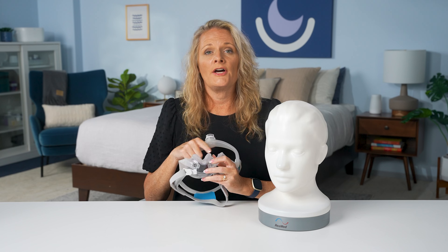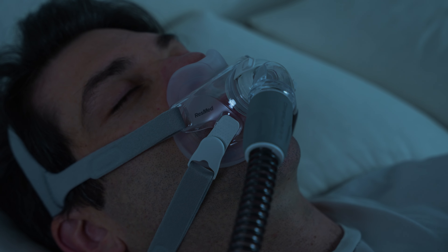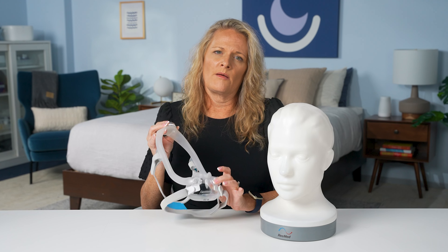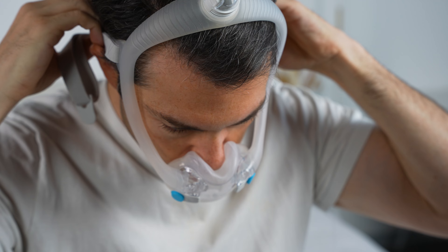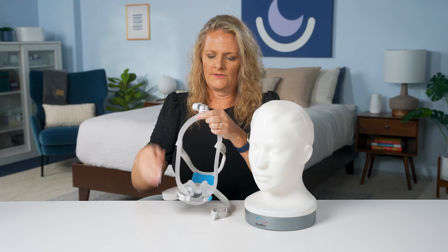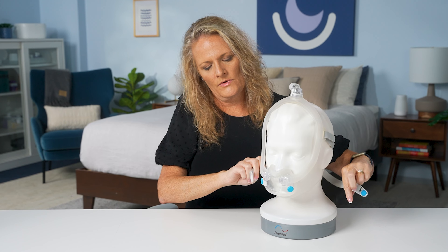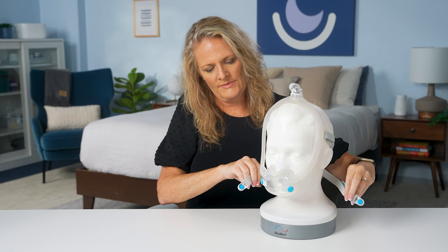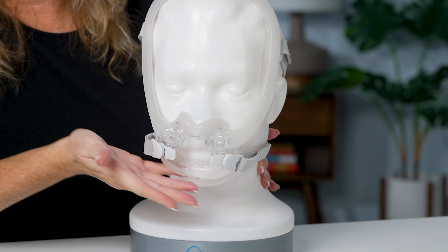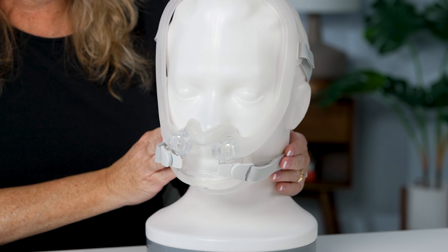The last mask style is the full face hybrid mask. It works similarly to a nasal cradle in that it sits under your nose, but it also covers the mouth to accommodate mouth breathers. This ensures effective therapy for users who breathe through both their nose and mouth during sleep. Many of these masks come with fit packs for different face shapes and sizes. To fit it: remove the magnets at the bottom, fit the nasal portion just underneath the nose and around the mouth, adjust your straps, pull them forward, and attach the magnets. Ensure there's no air leakage around the nostrils or around the chin, tightening straps from the top to the bottom if needed. This mask also gives you a free field of vision, so you can watch TV or read a book before sleep.